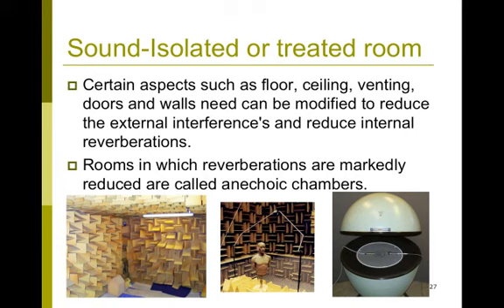Building a large anechoic chamber is, again, a very expensive process, but you still might find those anechoic rooms in some well-funded audiological research institutes. Apparently, NASA has a few anechoic chambers, and many of the hearing aid company research and development groups have these anechoic chambers.